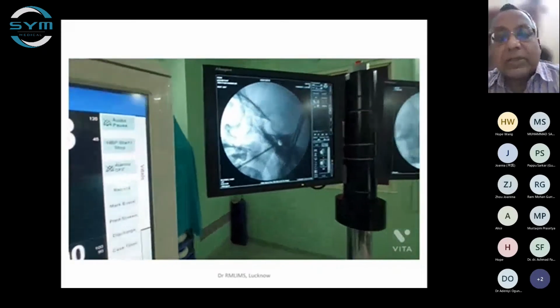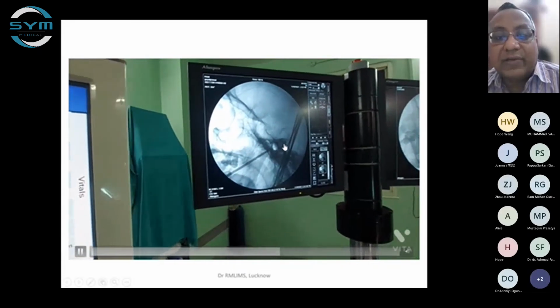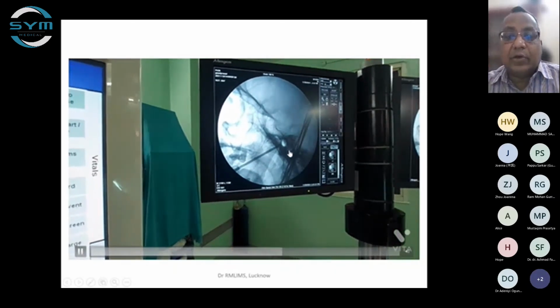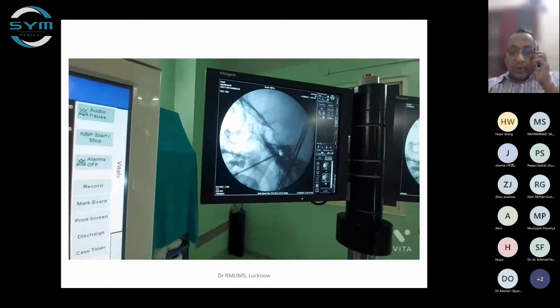And here also, you see, sorry for the unprofessional quality. But here is a marker, a steel marker, which is below. It shows you the exact depth of the balloon while doing it.